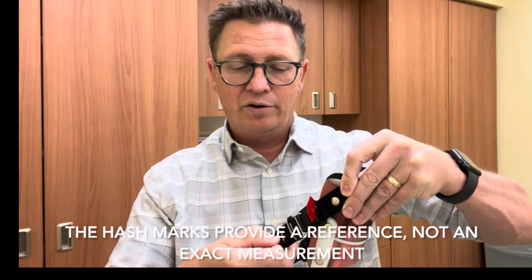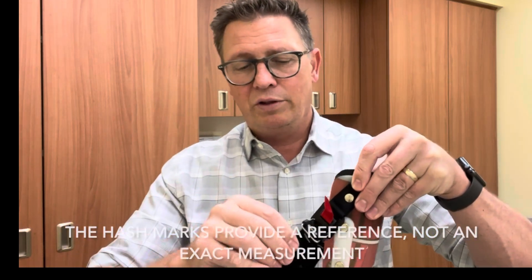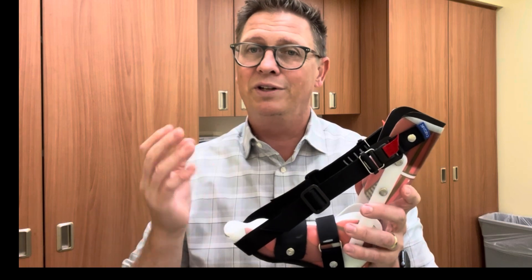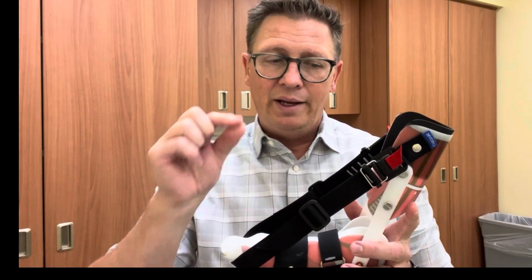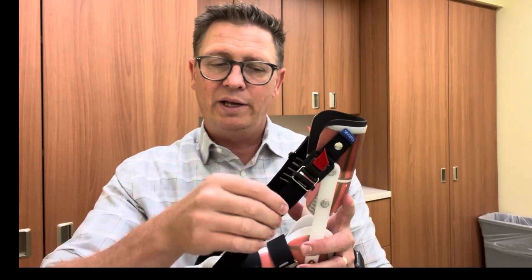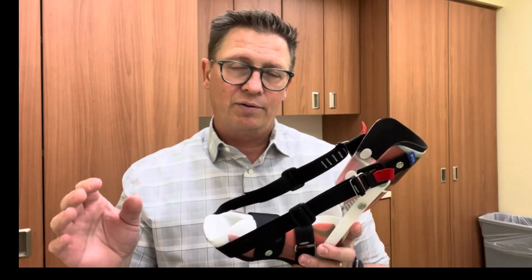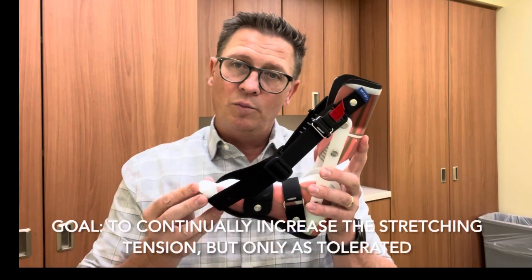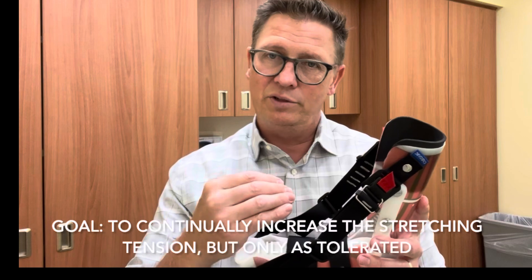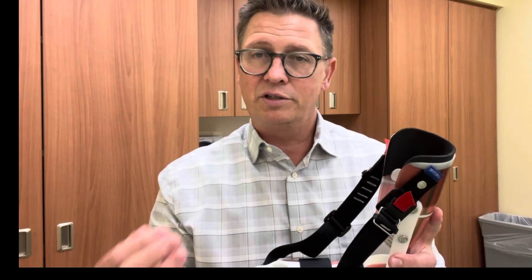Each time you increase the tension and go to the next hash mark, you're increasing the stretch on the foot by just a few more degrees. What we suggest is starting with a lower tension — a slightly less aggressive stretch — to make sure patients are comfortable and can tolerate wearing them while they sleep, then increasing one hash mark each week approximately. That's about a quarter of an inch increase in stretching tension each week, as tolerated. If you tighten the strap and get those few more degrees but it starts causing discomfort or pain, you know to go back down to where you had it before. Having these marks on the strap means you know exactly where you were.